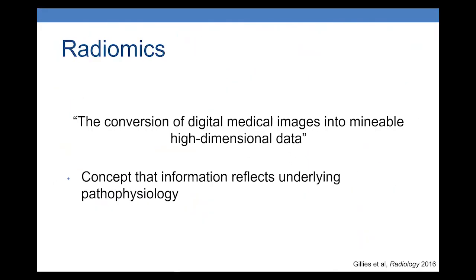This is what's going on now with all the artificial intelligence and machine learning trend and radiomics. Multi-feature is becoming a trend to improve the diagnosis of different diseases, and trying to correlate this with histology findings. In this study, we try to use as many ultrasound features as possible, quantitative features extracted by the computer, and correlate this with pathophysiology.